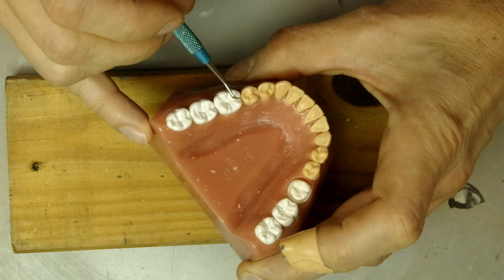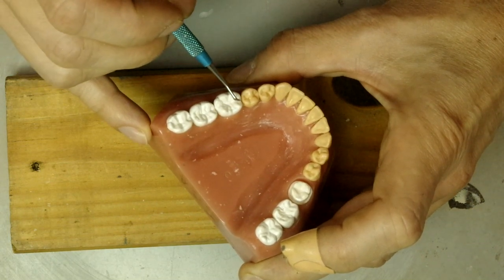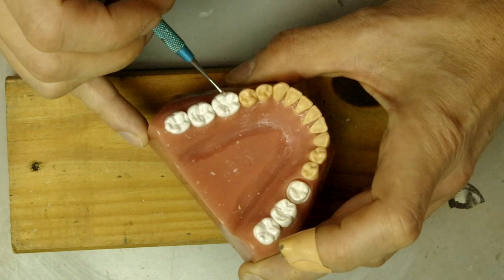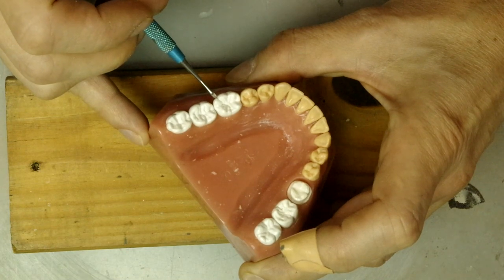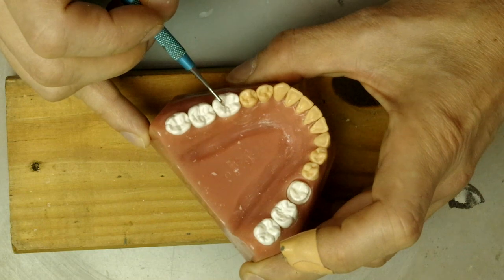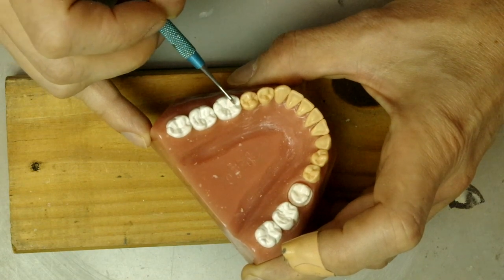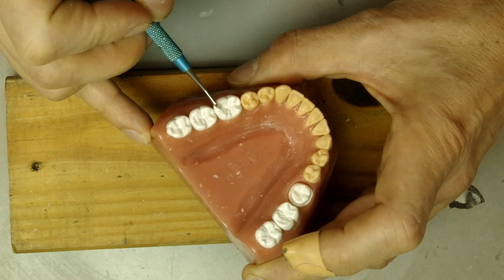These are our marginal grooves right here, the buccal developmental groove, the distobuccal developmental groove, and the lingual developmental groove right here. Then we have the central pit, the mesial pit, and the distal pit right here.